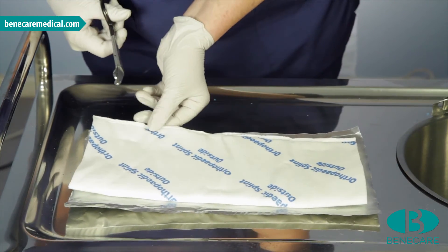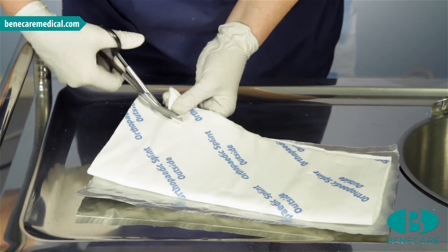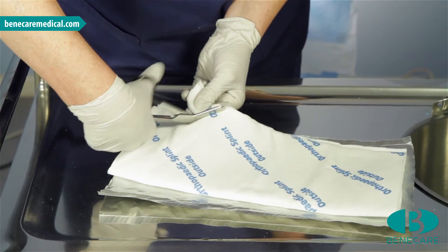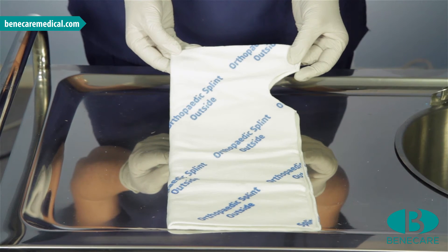The padding will need to be trimmed to follow the template of the splint, fitting a minimum of 1 cm within the edge of the padding. This is the template you are aiming for.